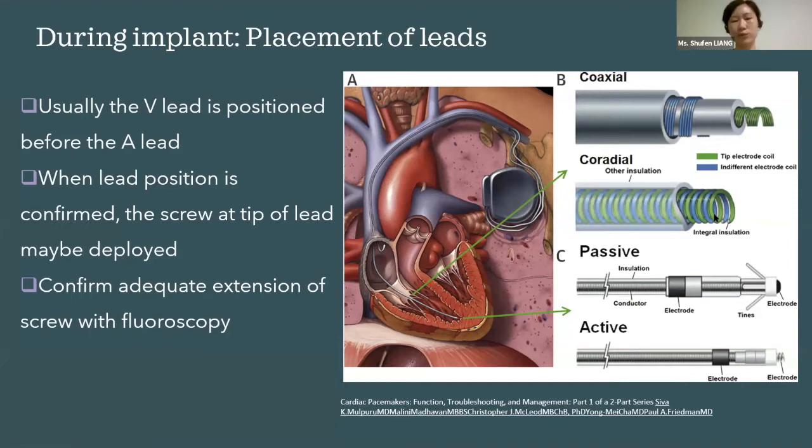If you didn't deploy enough, it might lead to dislodgement. And overextension might damage the lead. So we should just give an adequate number of turns.